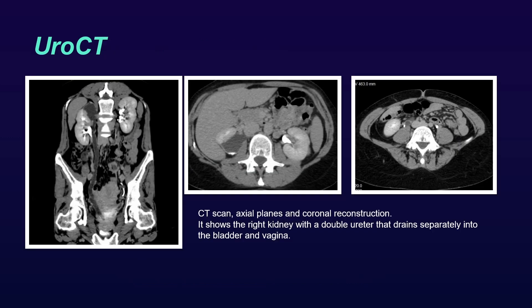On the CT scan, in axial and coronal reconstruction planes, we can see the right kidney with a double ureter that drains separately into the bladder and vagina.